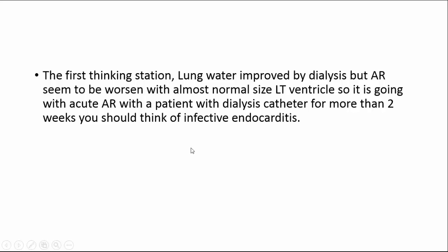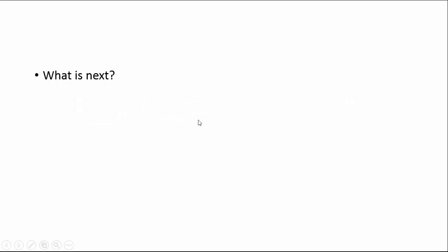This is the first thinking station. To be a good intensivist you need to be flexible and change your thinking according to changes in the patient. Lung water improved by ultra-filtration, but aortic regurgitation is worsening on an almost normal-sized left ventricle — no ballooning of the left side. This is going with an acute process. What acute process can cause acute aortic regurgitation in a patient with a dialysis catheter in place for more than two weeks? You should think about infective endocarditis. Fortunately, we have a TEE available in our ICU.